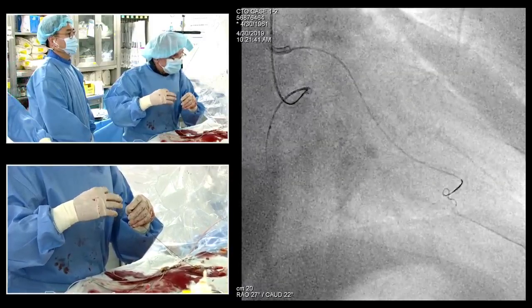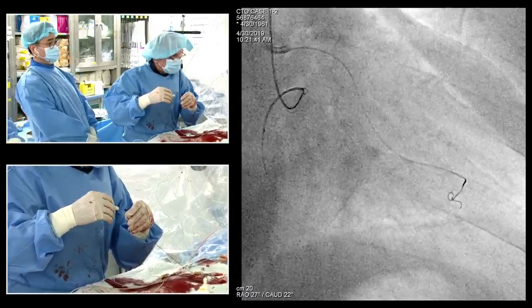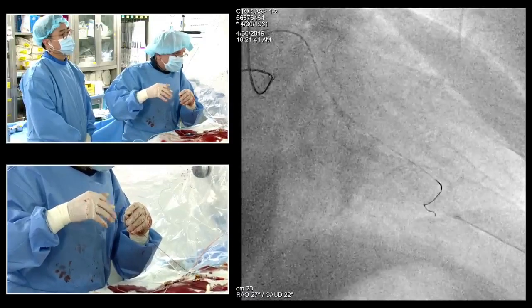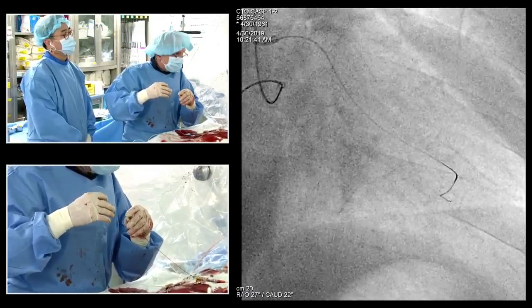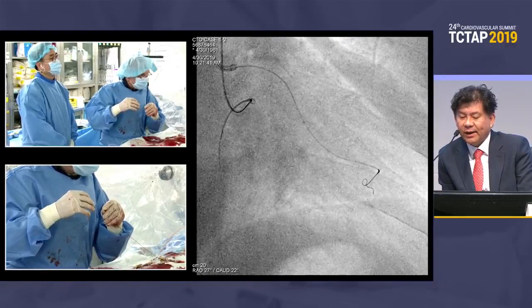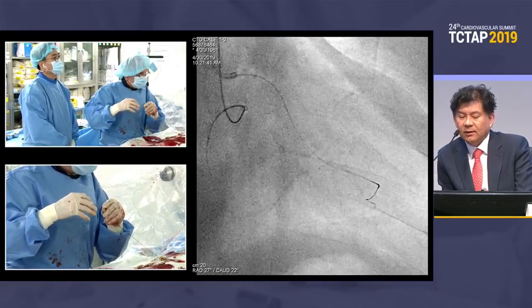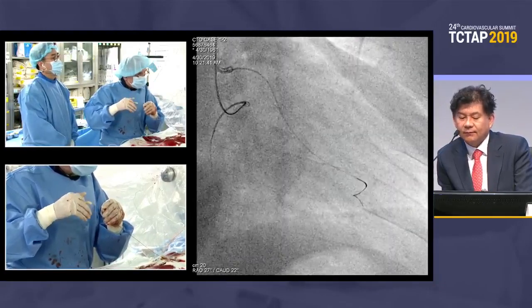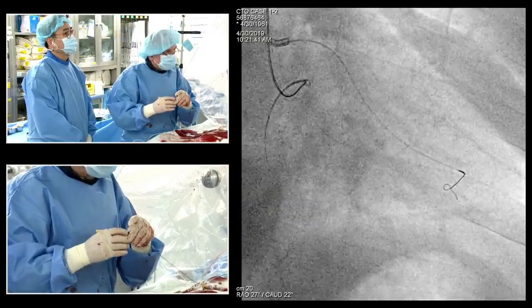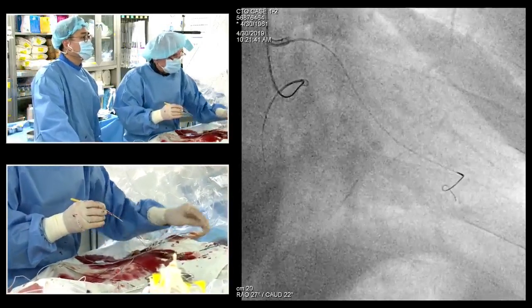Doesn't have more control on the distal tip now. For this kind of very ambiguous distal communication, before wiring, in my case, I would prefer more effort to clearly visualize the distal connection from another angle with a more selective injection here. But I have the connection here, and I have the reference image. The problem is more the bend that takes away the forward movement of my wire.